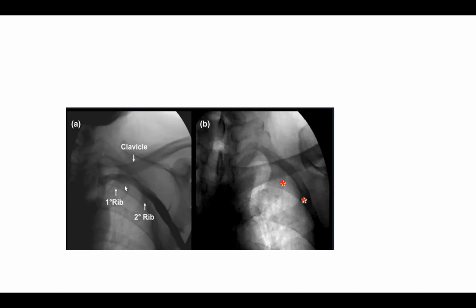So see the first rib here, see the first rib under the venogram, then see the clavicle. So you can see where that first rib is, just at that point, very close by, just take your needle, peer vertically to that point and puncture. But under venogram, you have seen it. On venogram, while the venogram is going on, you can even puncture the axillary vein. And the beauty of getting into the axillary vein, you will have no pneumothorax or hemothorax in puncturing axillary vein, because you didn't enter into the pleural space. That is one of the key things that we must realize from this discussion.